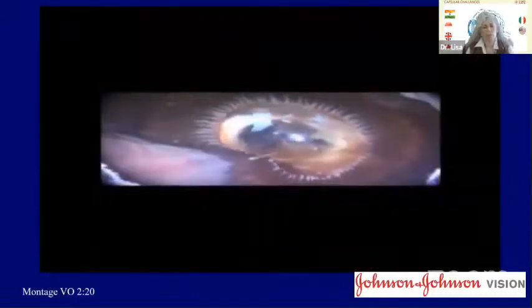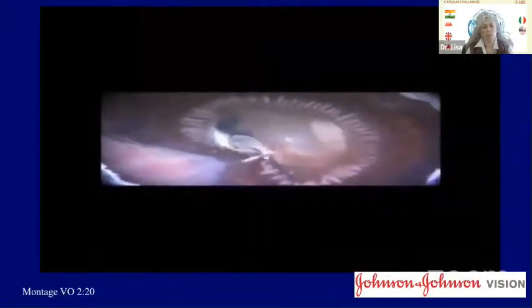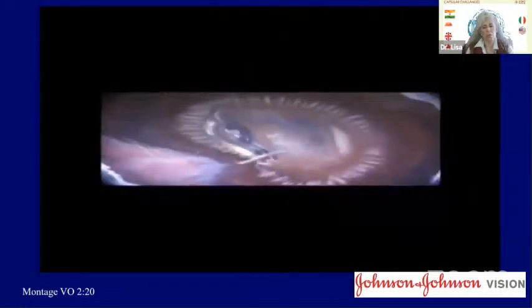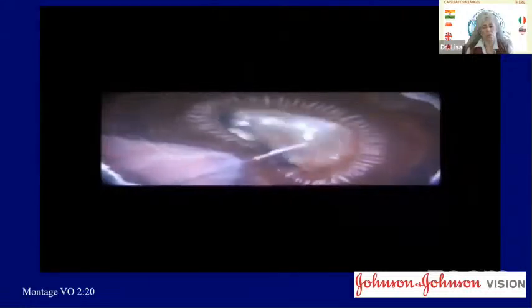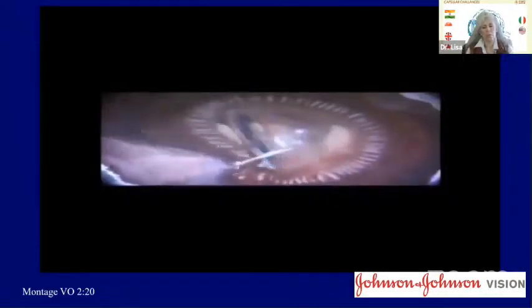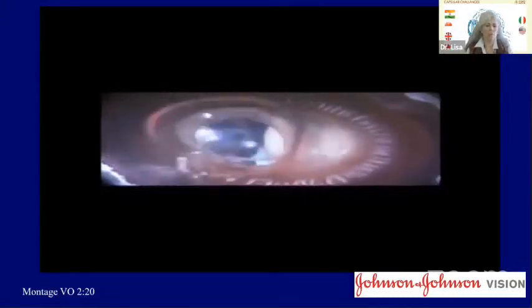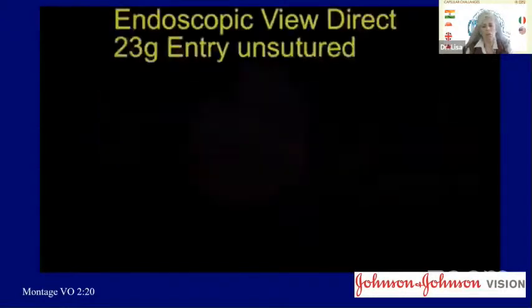Here we're going to see that we can only apply the trocar when we know that we have a firm eye, because you can see the kind of pressure it takes. I'm showing this Miyake modified view that Liliana Werner helped me with in order to demonstrate the pressure, and also to show in your mind's eye what's happening inside. In the pars plana, you can see how it tilted backwards because we had a really good scleral tunnel, and then when we bring the vitrector through the cannula, it comes through again.